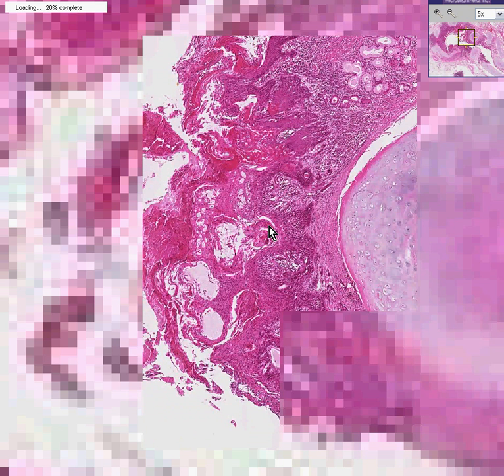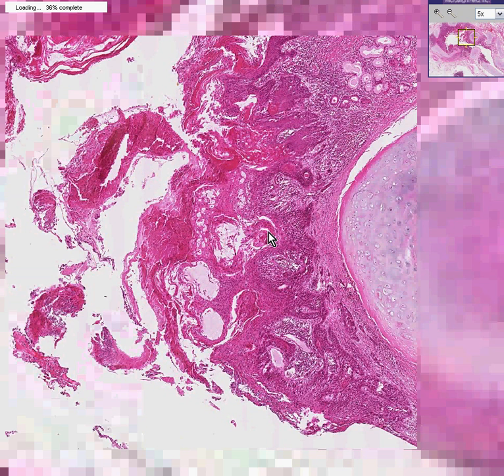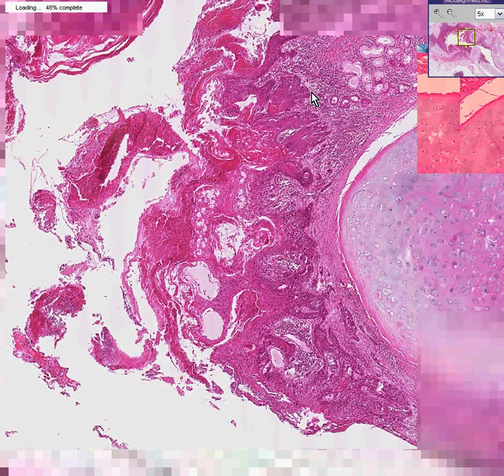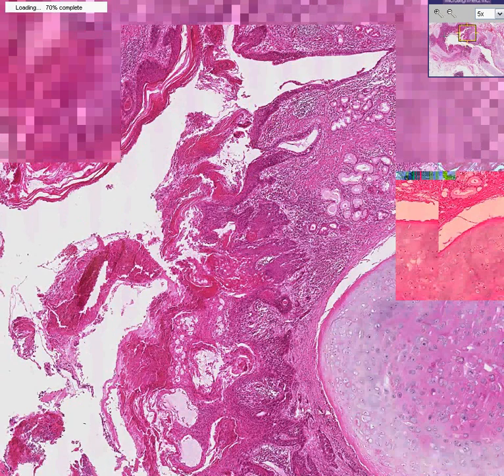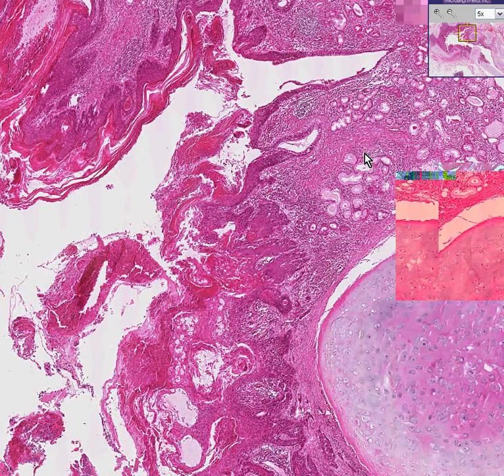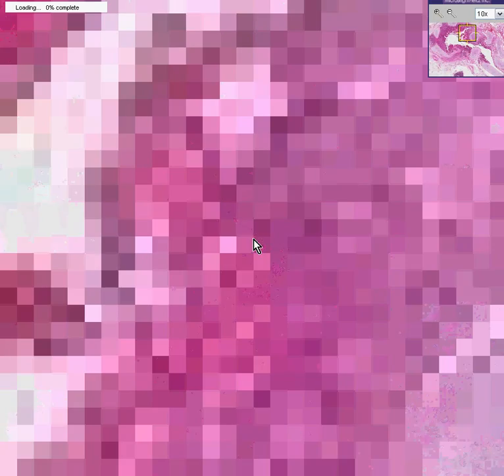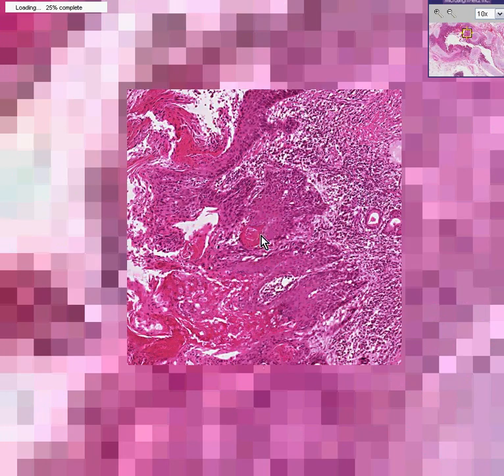I think I could convince you that there's a little pearl here — let's go a little bit closer. Yes, this is a pearl. This is a relatively well-differentiated tumor, and it would behave better than a moderate or a poorly differentiated one.